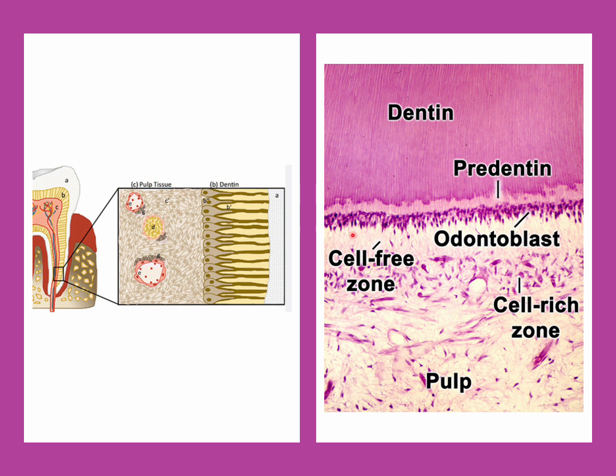Under the microscope, we can see this layer of odontoblasts looking pseudostratified, as we have explained. I explained that because of cutting the pulp at an angle, the cells look stacked over each other. Remember this layer above the odontoblasts? We called it predentine in the dentine practical session.